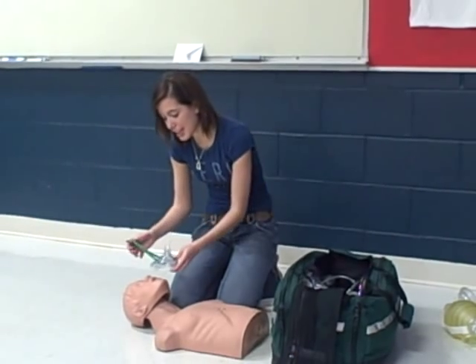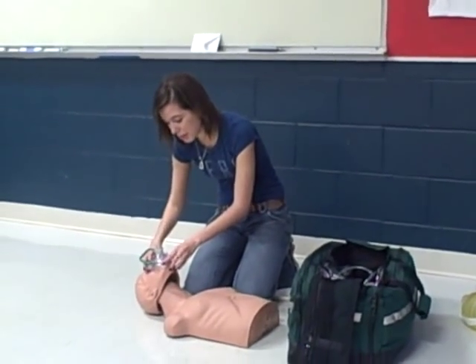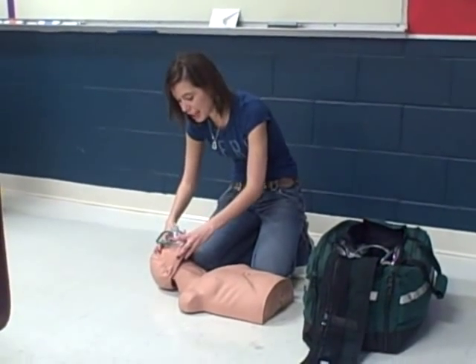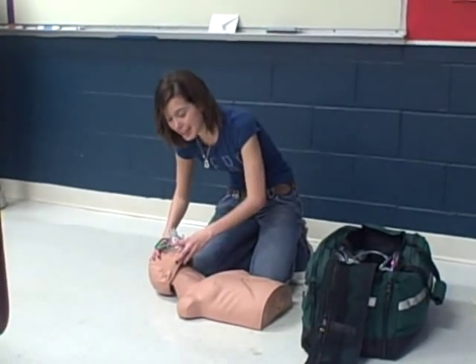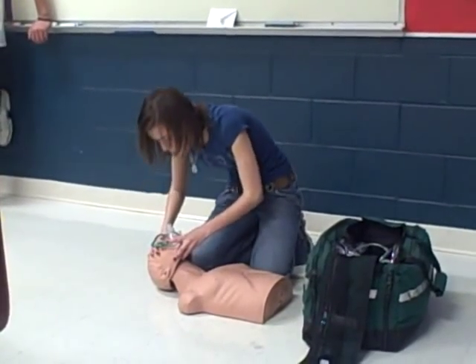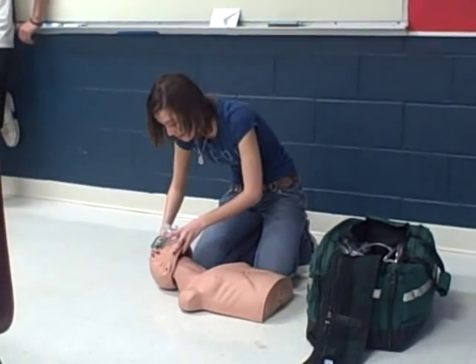I will do a chin lift and place the mask on my patient with the correct face-to-mask seal and do ventilation for 30 seconds. 1-1000, 2-1000, 3-1000, 4-1000, 5-1000.